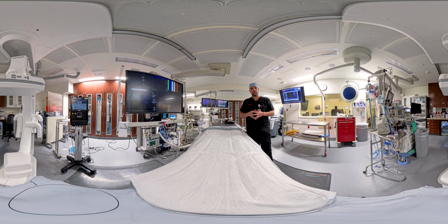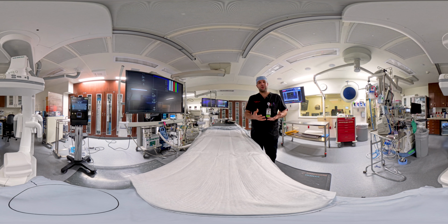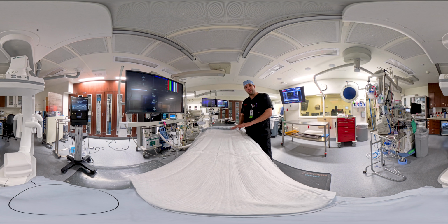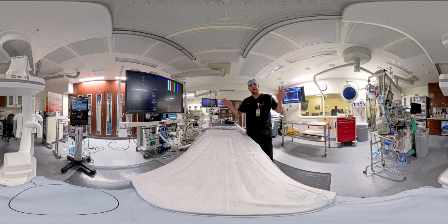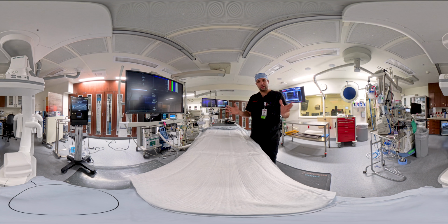The way that the procedure goes is that once you are comfortable and once your breathing is stable, we will start the procedure. We will cover you with sterile draping, and someone to my right will be helping me. I'll begin by giving some numbing medication to your right groin, and this is where I will access the femoral vein. Through that femoral vein, I'll be able to pass a catheter or a wire, and that wire is connected to our system that will show me the data that I need.